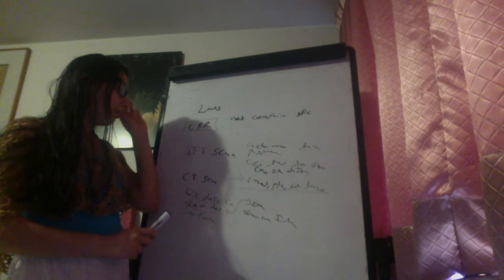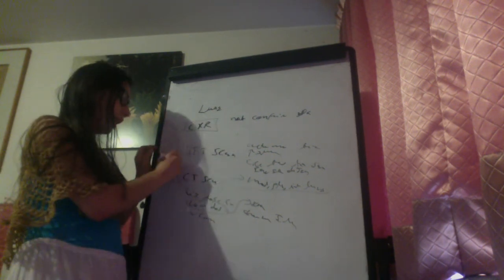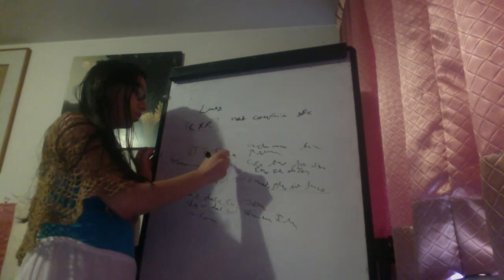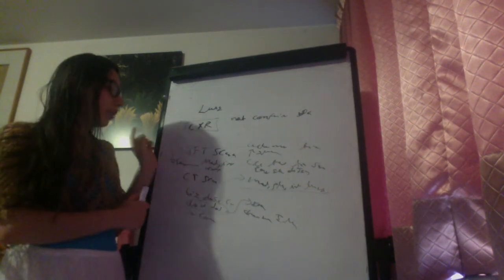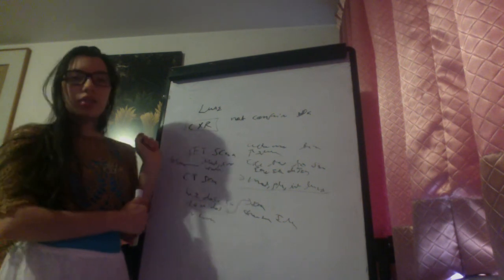And the PET scan differentiates between benign lesions and malignant, infectious, and inflammatory lesions. A benign lesion could be, for example, scarring tissue. Both cannot differentiate between malignant, inflammatory, or infectious lesions.